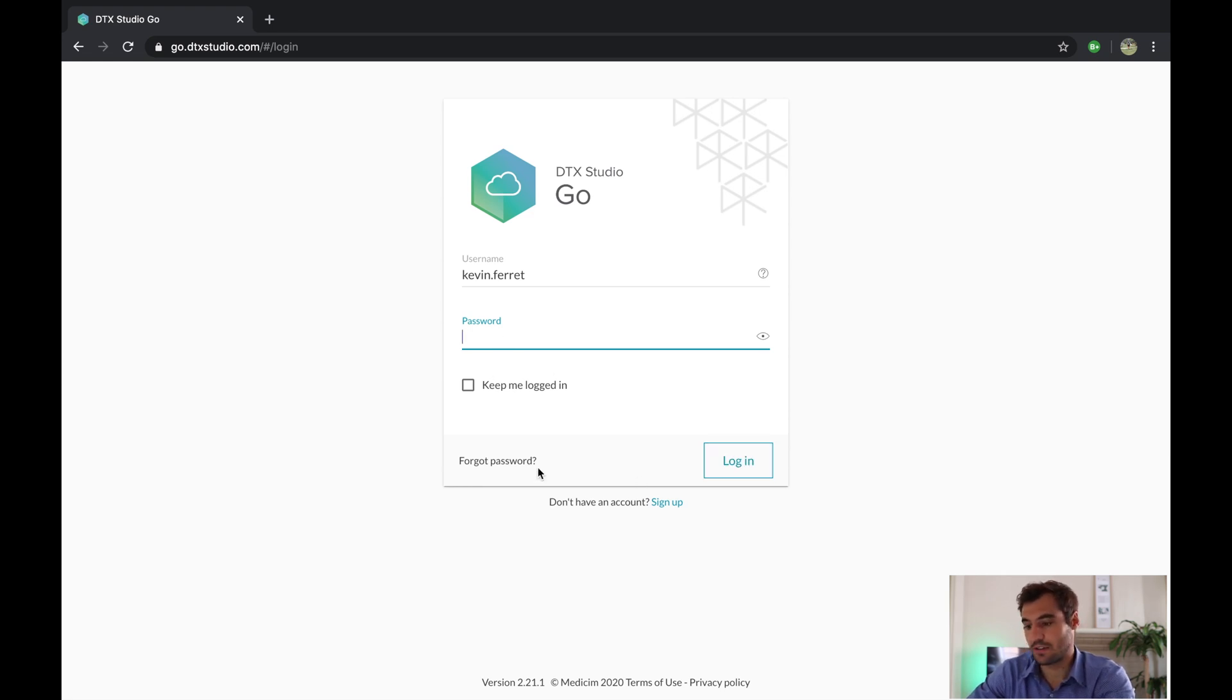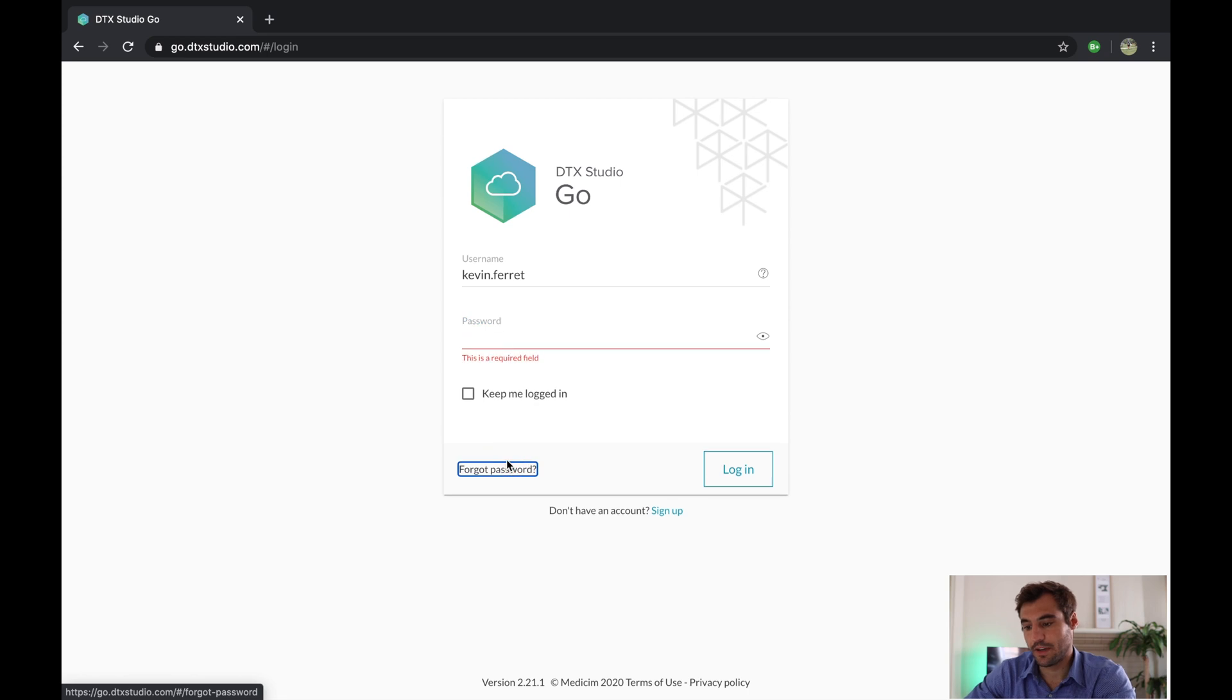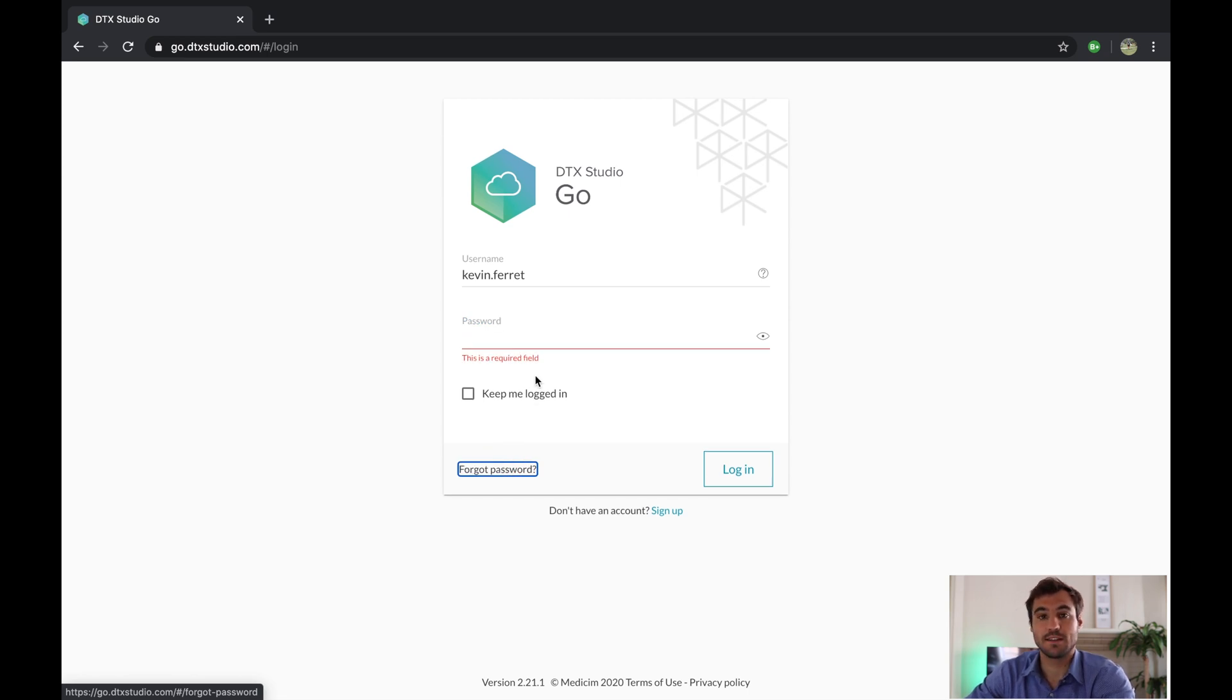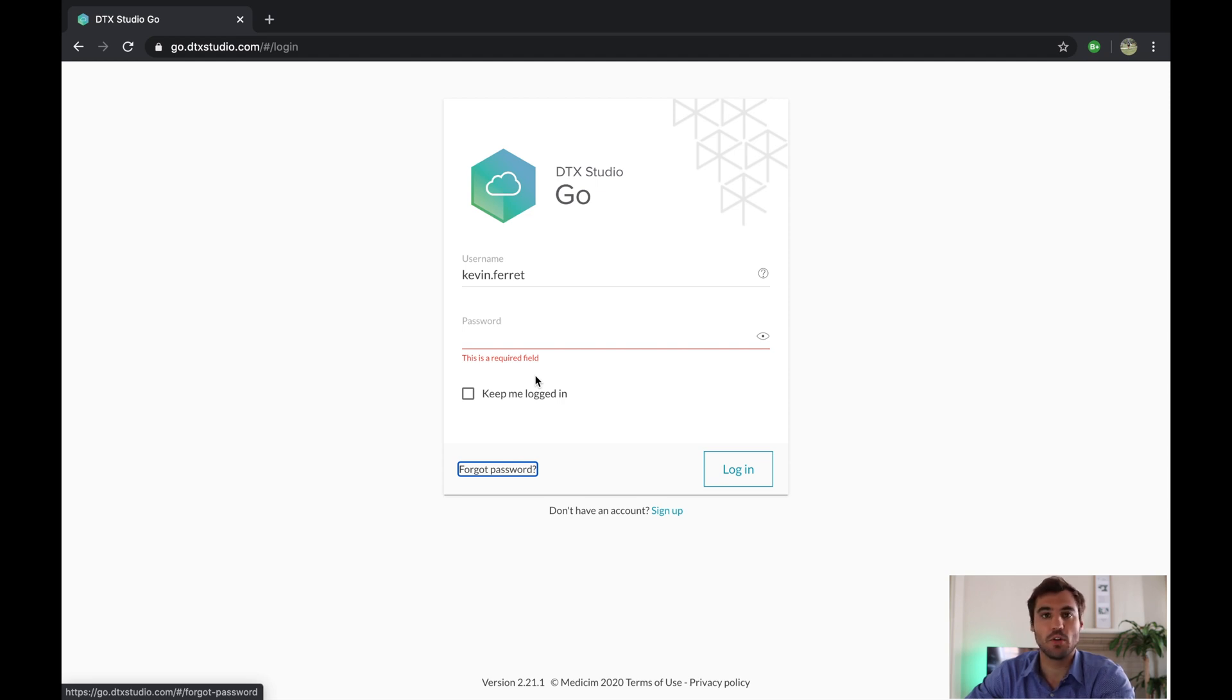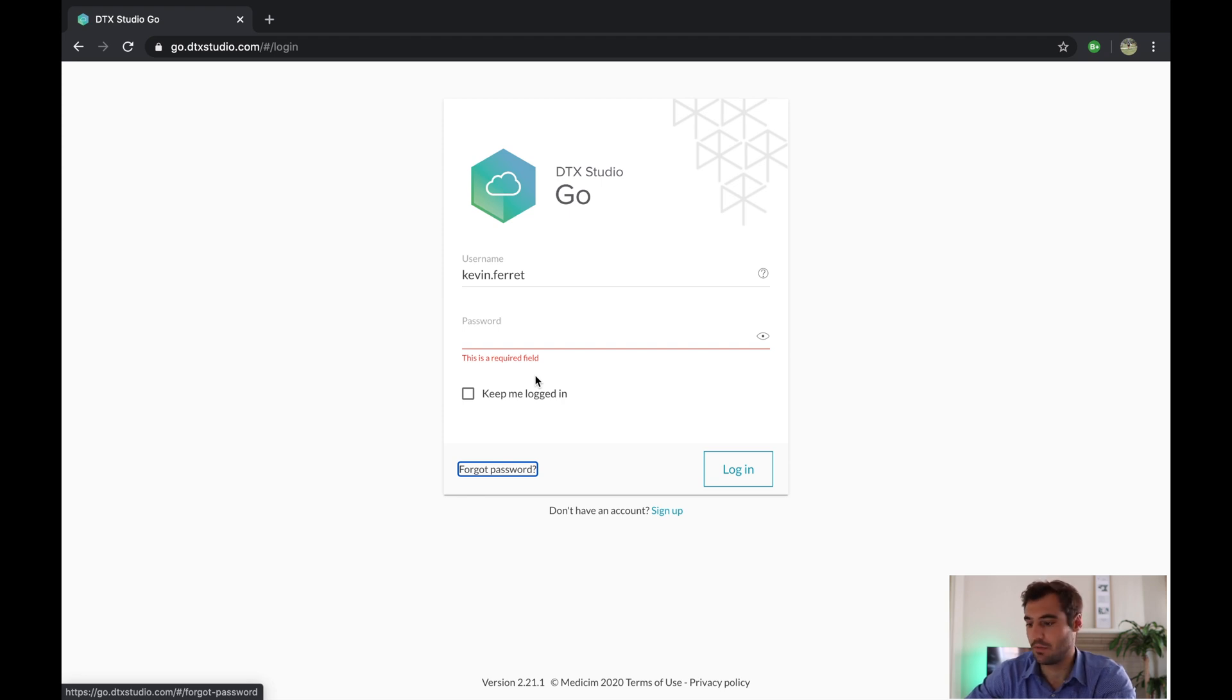Just click on forgotten password and this will take you to another page and we'll send you a link on your email, whichever email you've set up your account with. If you don't remember which email you used to set up your account, just reach out. We'd be more than happy to help you with that.